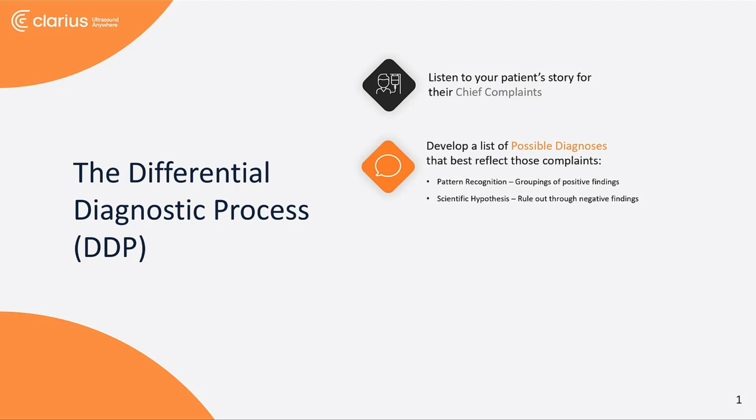There's 2 different strategies that have been identified for coming up with these possible diagnoses, and the first of which is simply pattern recognition. Much like computer machine learning, clinicians have gone through enough exposure to various diagnoses or various chief complaints that they can put together their best guess as to what the diagnosis could be.